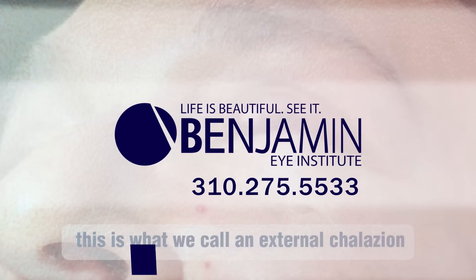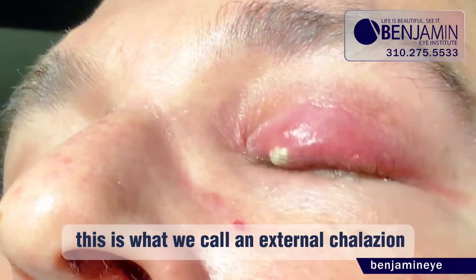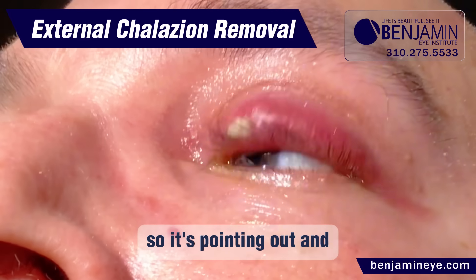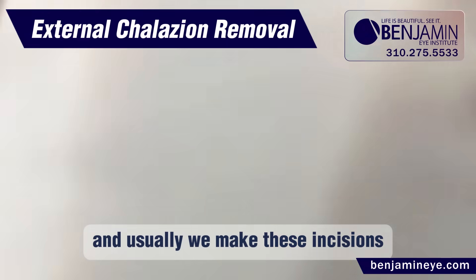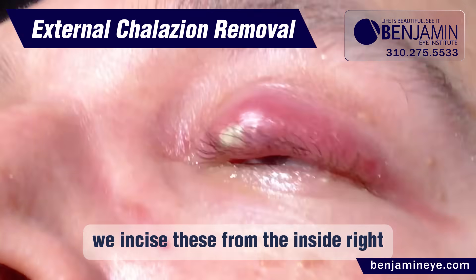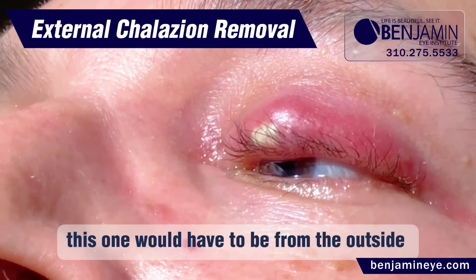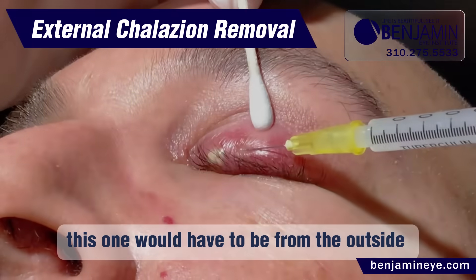Numbing drops. This is what we call an external chalazion. Usually we make these incisions from the inside, but this one would have to be from the outside.